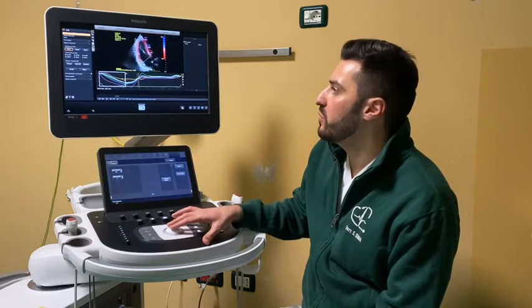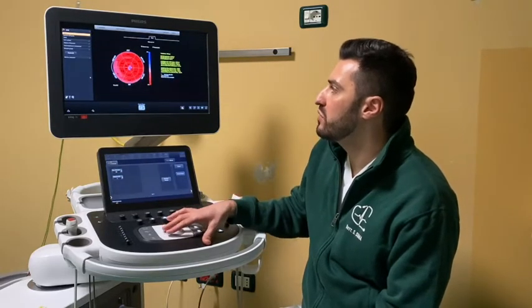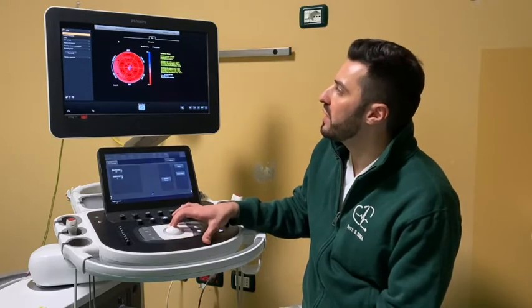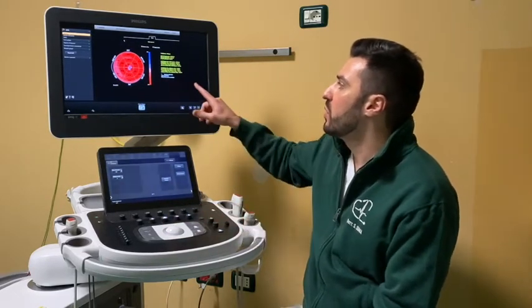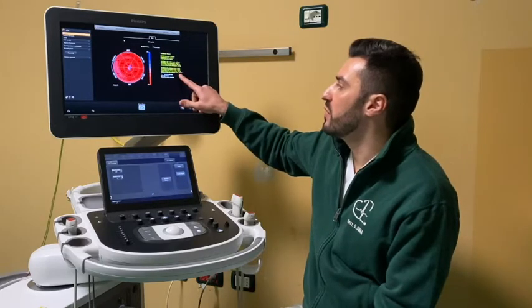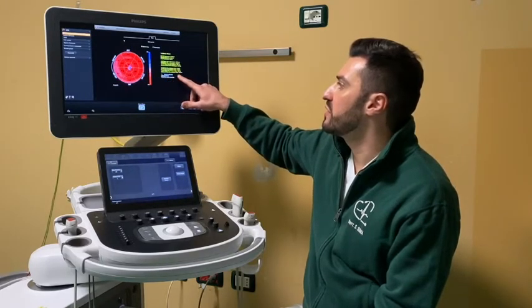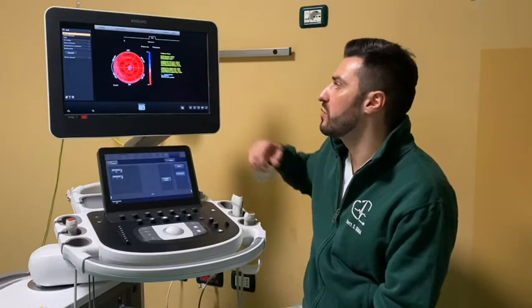In the end we will have a bullseye that reflects all the segments of the left ventricle, with a sum of these values which is the GLS, the global longitudinal strain.